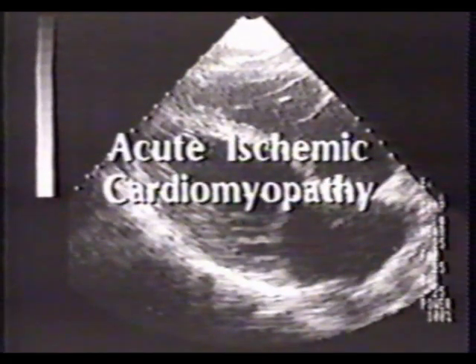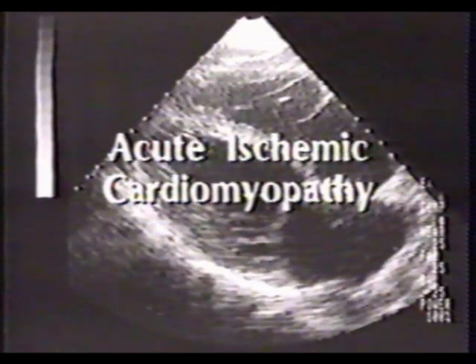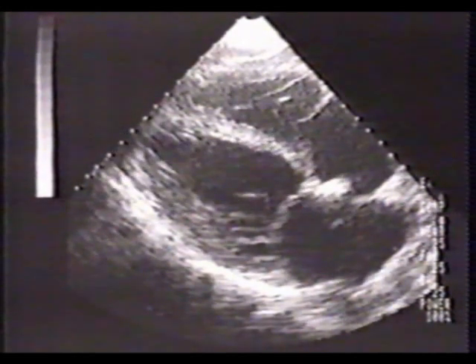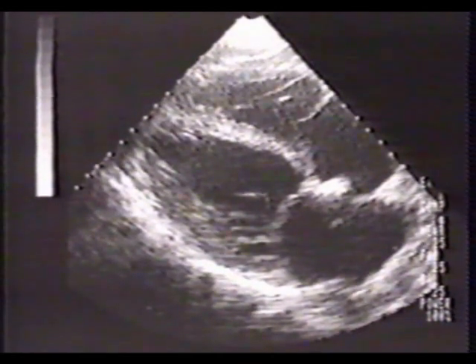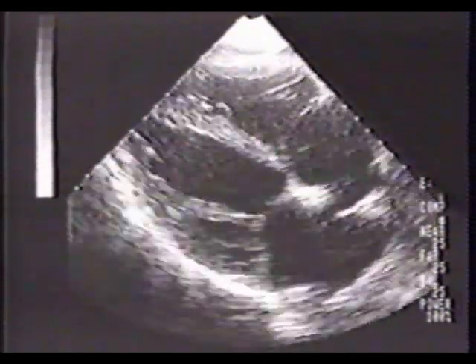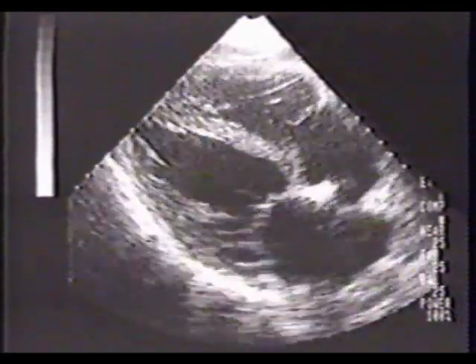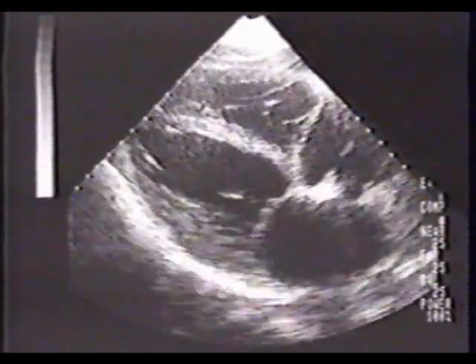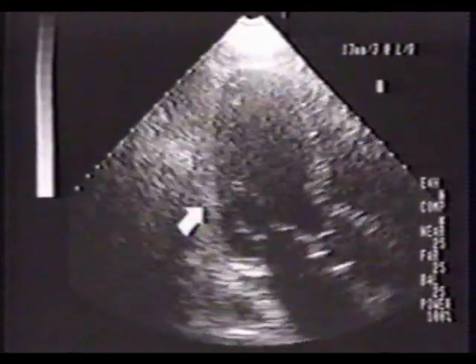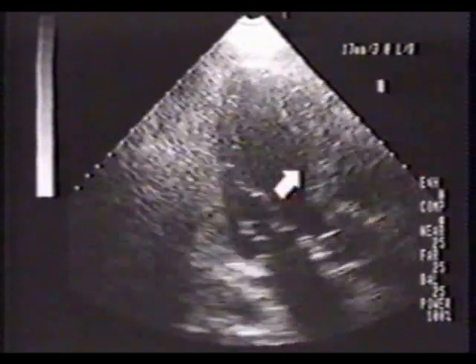This patient's first symptom of coronary artery disease was acute infarction, and he presented to us several hours into the infarct in a severe low output state. Echocardiography demonstrated that this was due to massive left ventricular involvement, resulting in an acute ischemic cardiomyopathy. This is a subcostal four-chamber view. His infralateral wall shows some preservation of contractility, but this is offset by septal dyskinesis.